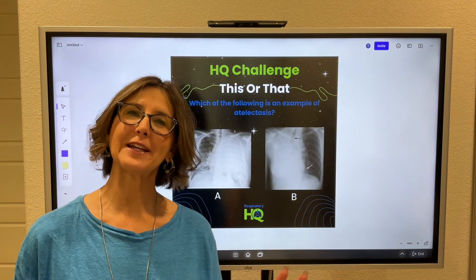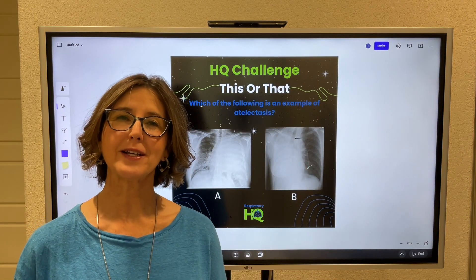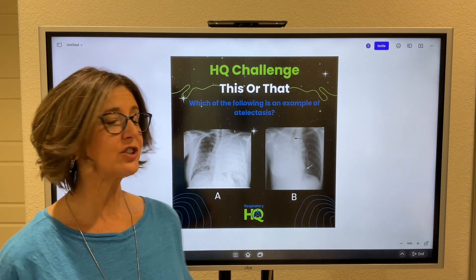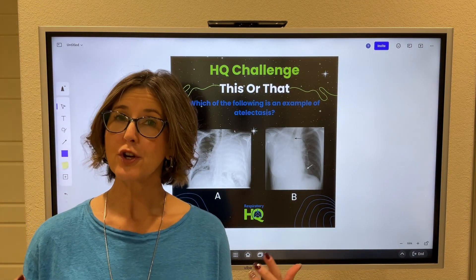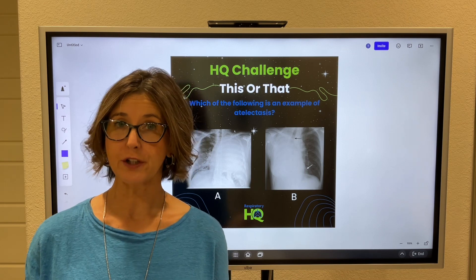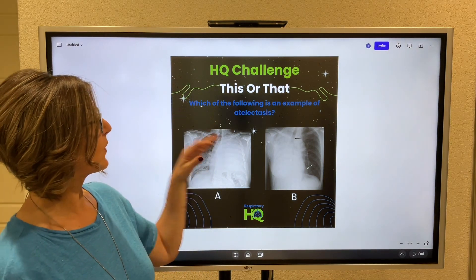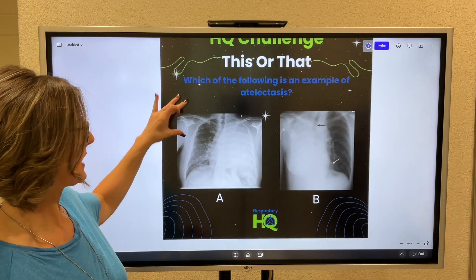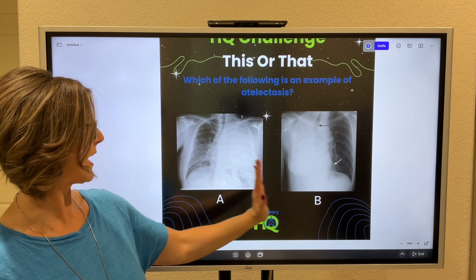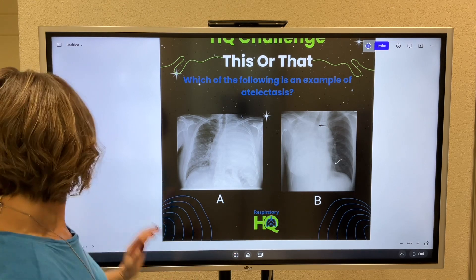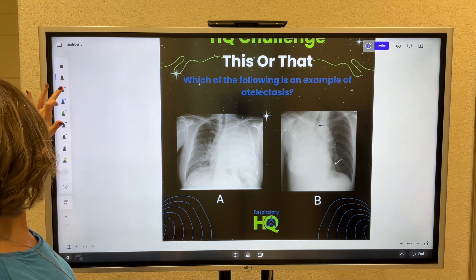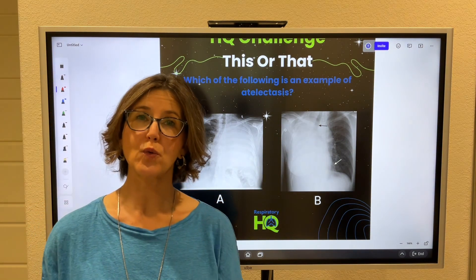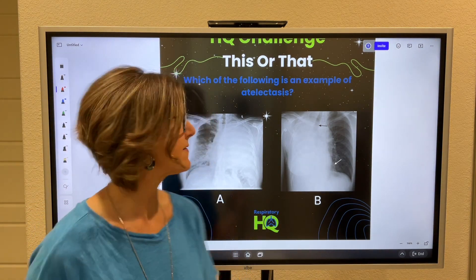Happy Respiratory Care Week, everyone. This week's HQ Challenge deals with tracheal shifts. Which of the following is an example of atelectasis, either A or B? What I want you to note with each one of these is that we have a tracheal deviation.